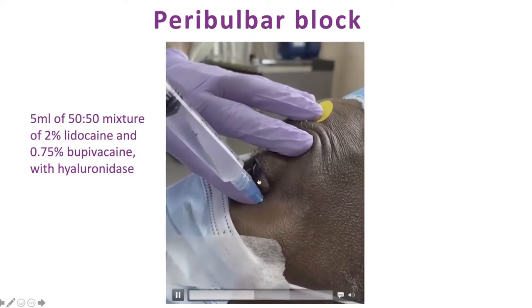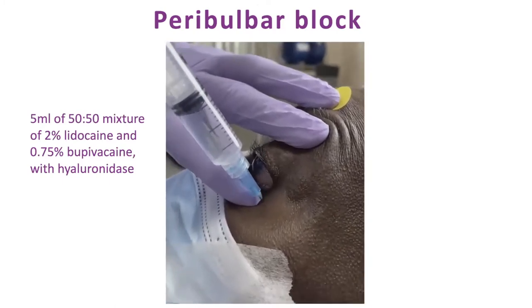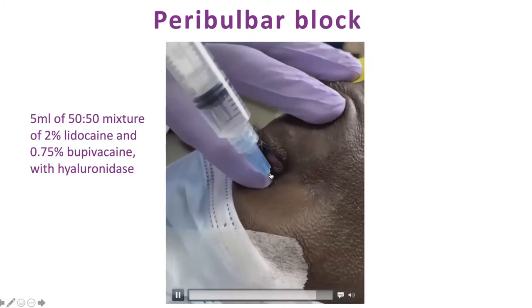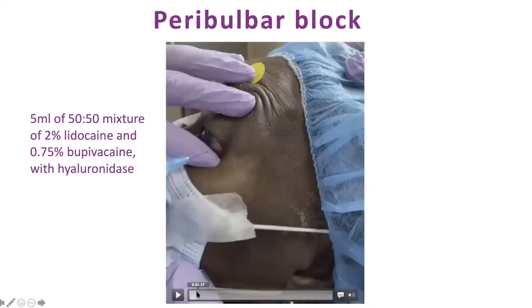Watch carefully how our anesthesiologist does this and how short the needle really is. Once you push the globe back, your needle is behind the equator of the globe — it's anatomically impossible to hit the optic nerve. This is a 5/8-inch needle and it's not even halfway in. He only does peribulbar, and you'll see the same patient on the next slide: complete akinesia, didn't feel a thing during the entire surgery.